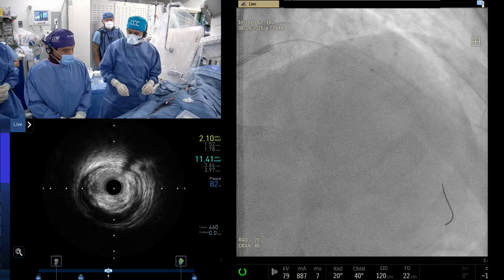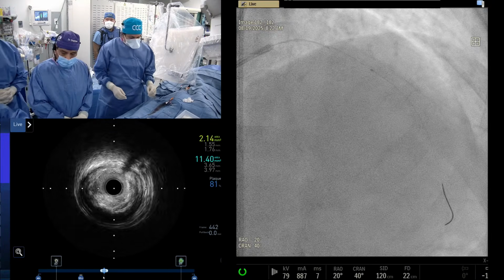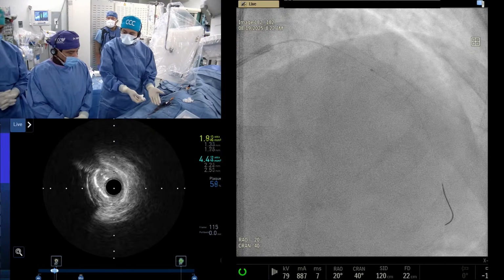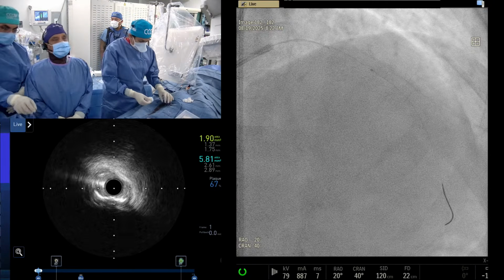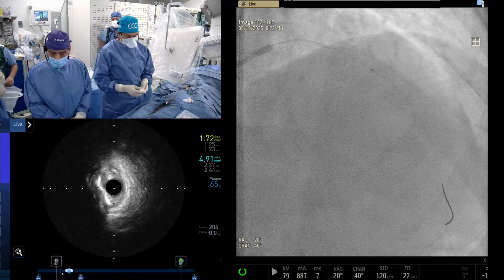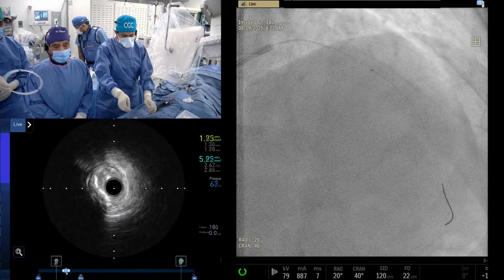Don't just do a balloon. Yes. We are teaching what's the right thing. They wanted imaging, we did imaging. It's barely 1 quadrant calcium. Do you want to wire the diagonal now? Yeah, do the wire, the feeler wire in the diagonal because the diagonal has to be taken care of. The young person, you need to do that.